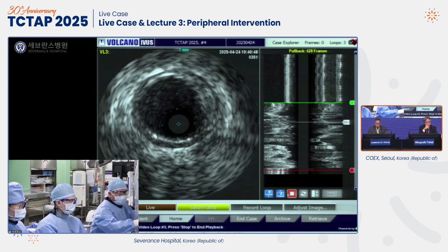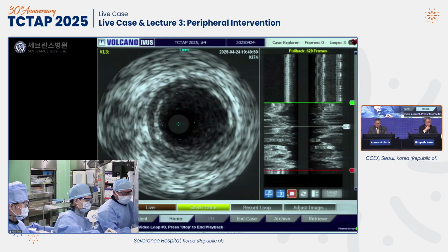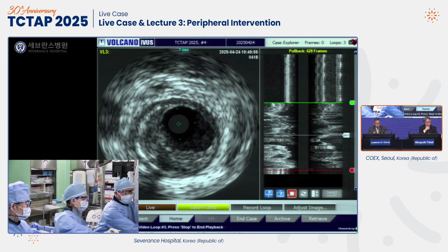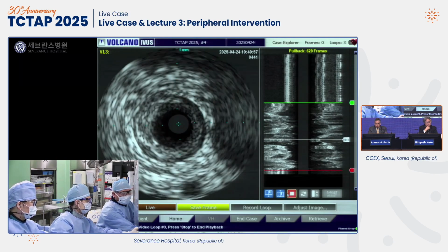of an artery, which is what Abacus tried to get to. But this just shows you the plaque volume is still 60, 70%. It's really trying to make a lumen that's normal for the vessel at this point.